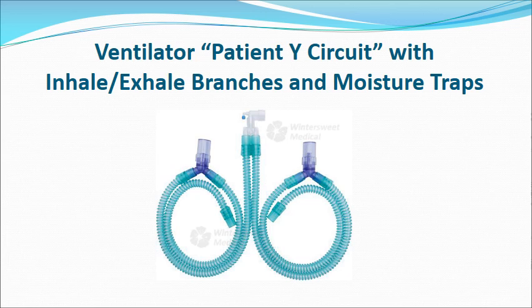So we have a couple of small tubes in addition to these inhalation and exhalation paths, which convey information back to the ventilator. Also, we have a PEEP valve on the exhalation path, which keeps the pressure after exhalation at a positive value. We'll discuss that later.